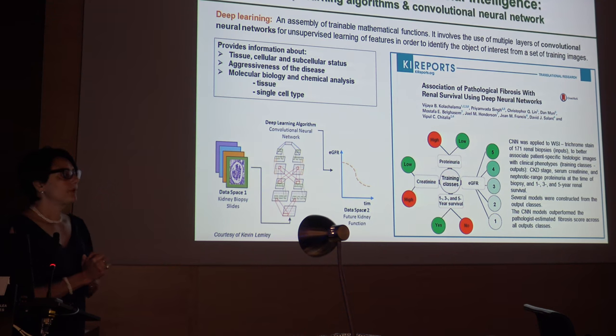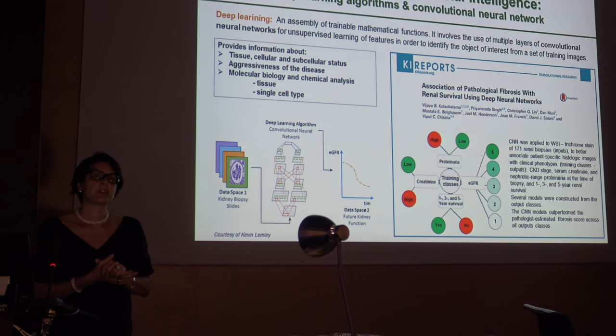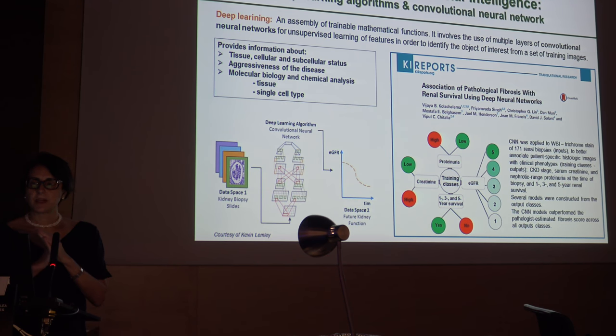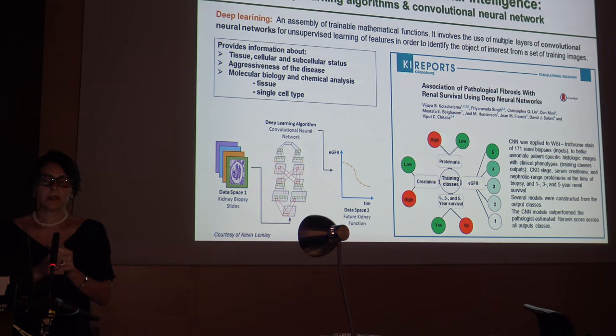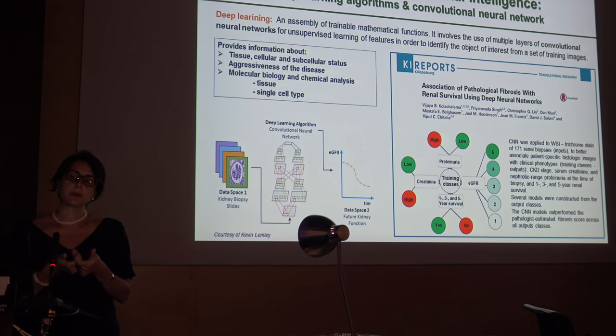What are the novel approaches that we start applying? And the first few papers just start coming out this year, I have to say, is artificial intelligence, and that you can apply only if you have a digital image. Deep learning algorithm and convolutional neural network. What is deep learning?